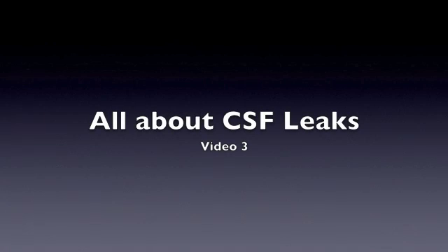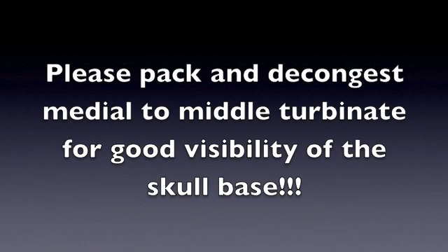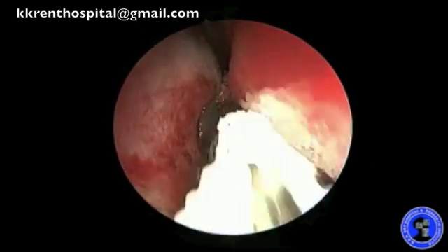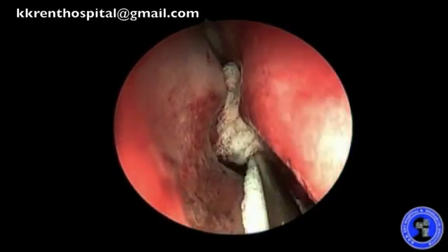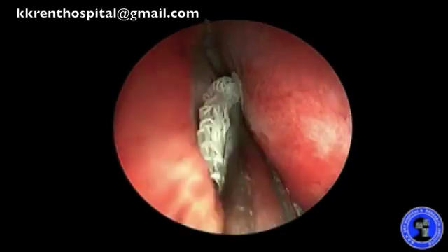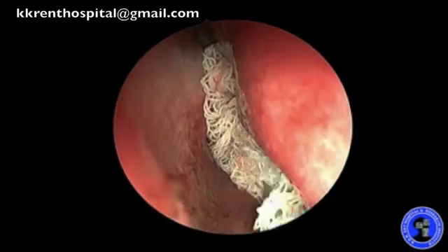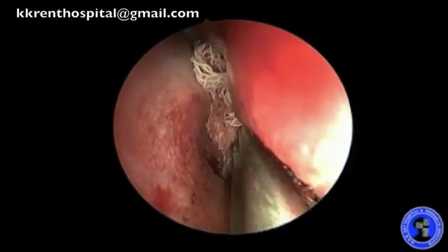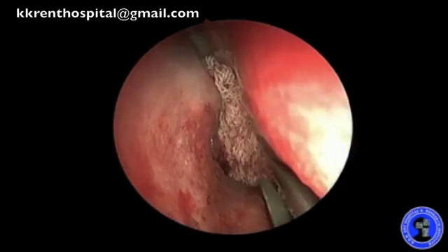Functional endoscopic sinus surgery is all about decongesting the mucosa and controlling the bleeding for good visibility. It is extremely important that the skull base area medial to the middle turbinate is packed and decongested to have good visibility of the site of the CSF leak, which is often in this region. I use a very strong adrenaline solution and ribbon gauze, which helps me achieve the pressure required for adequate decongestion.